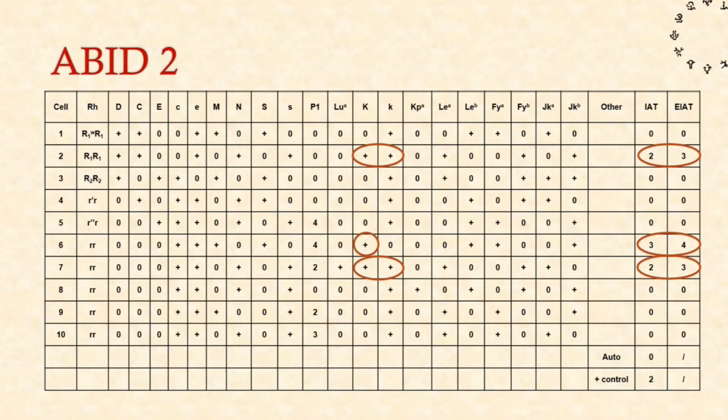So we've got another antibody ID here for you. And this one, I'm not going to go through all the exclusions because it does take quite a bit of time. But I'll just give you a moment to have a quick look at the positive reactions and see if you can match any up, for those of you who've not had a chance to do that.